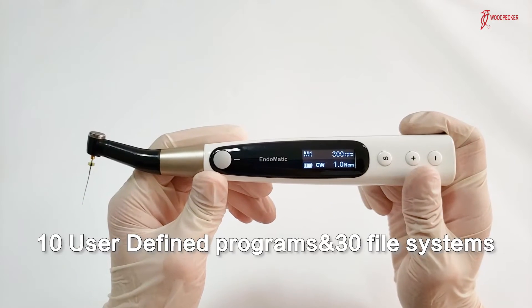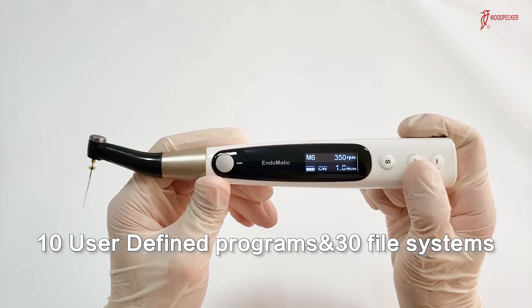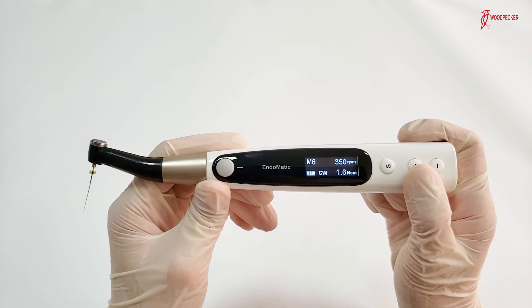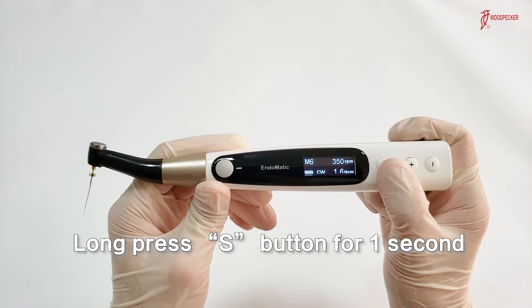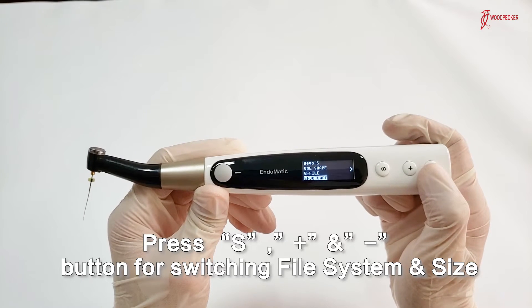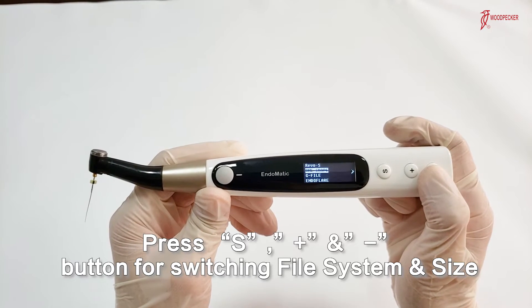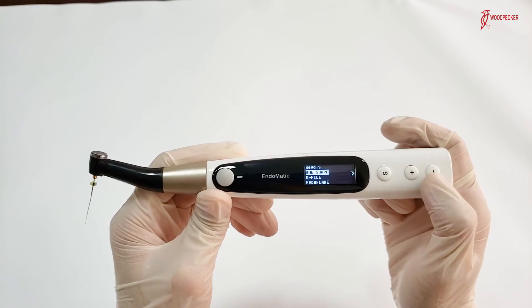Endermatic includes 10 preset user-defined programs and 30 file systems. You can select different file systems according to your demand. Long press the S button for one second, then you can select from these 30 file systems and file sizes by pressing the S button and the minus and plus buttons.